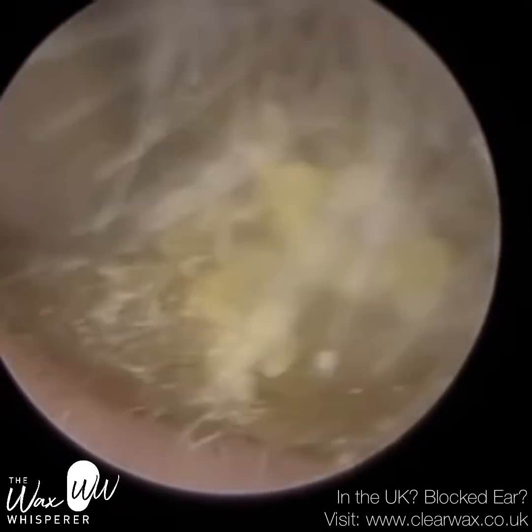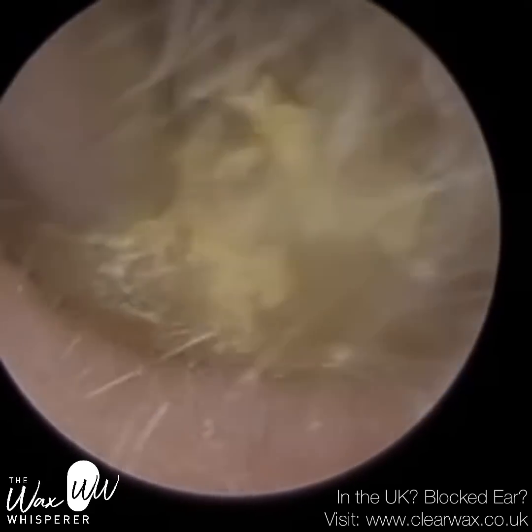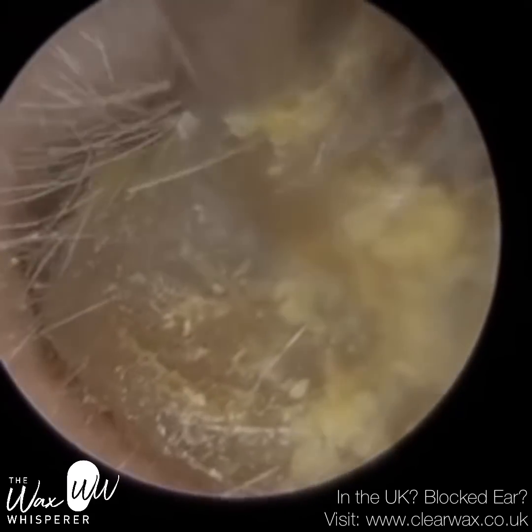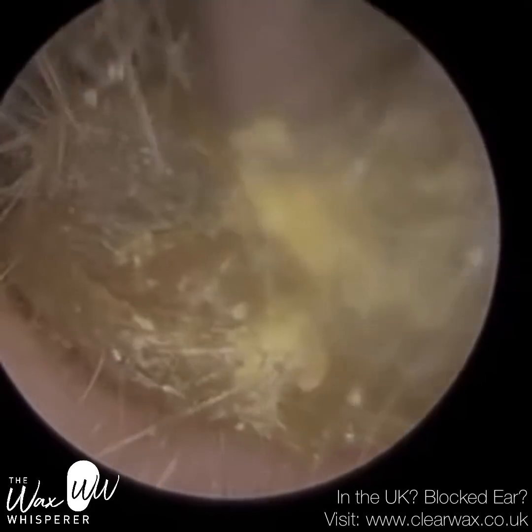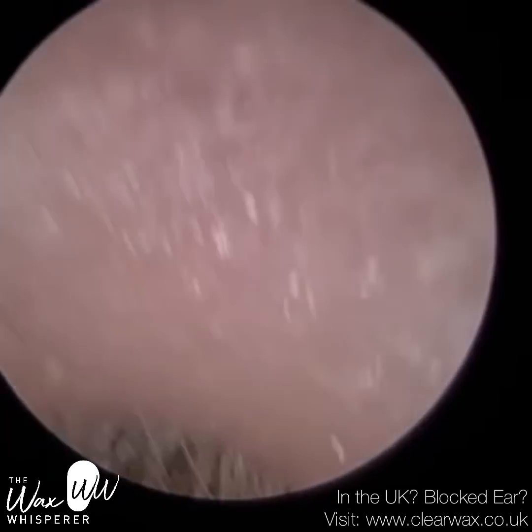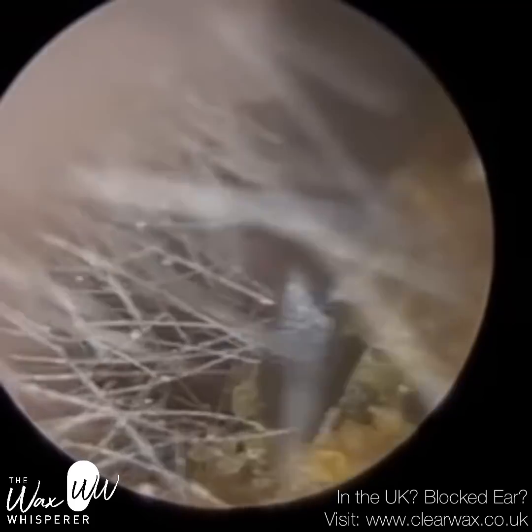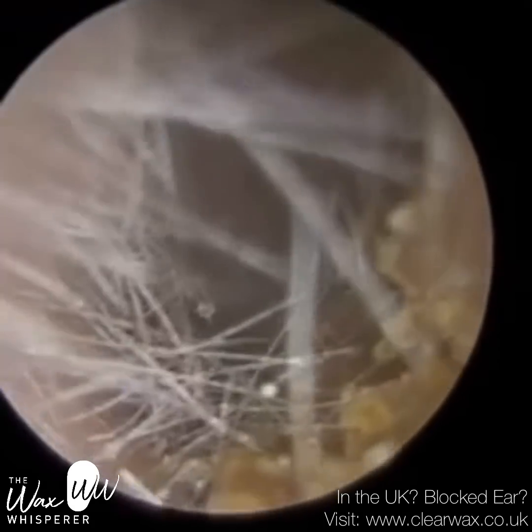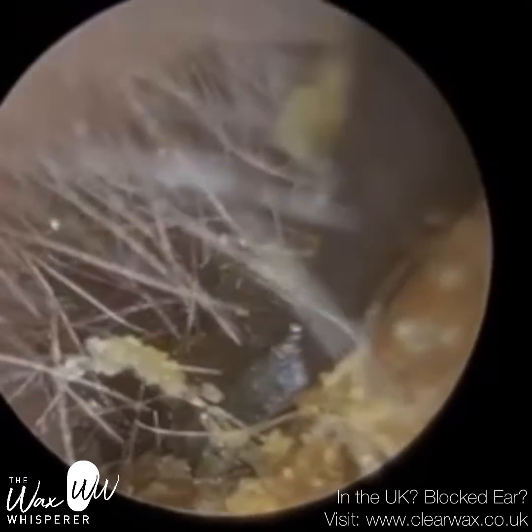Prior to endoscopes, microscopes or head loops were used to look inside the ear. I've started off on this same patient — this is their left ear — and I'm going to use the EyeClearScope, which is the original device that Clearwax launched back in 2015, to extract the wax. Then on the right side, I'm going to use the Waxscope.